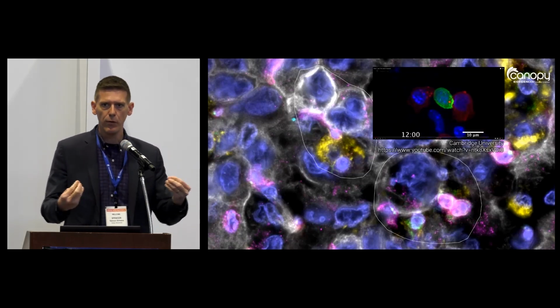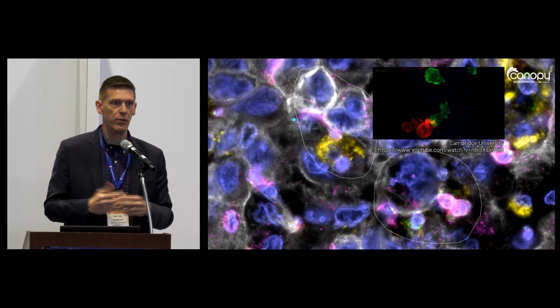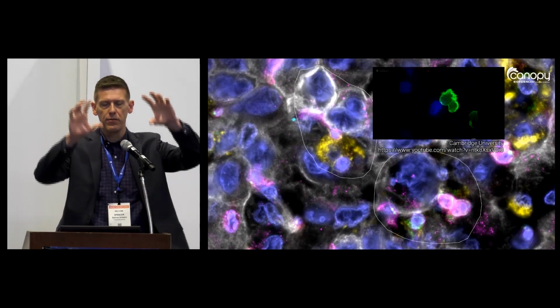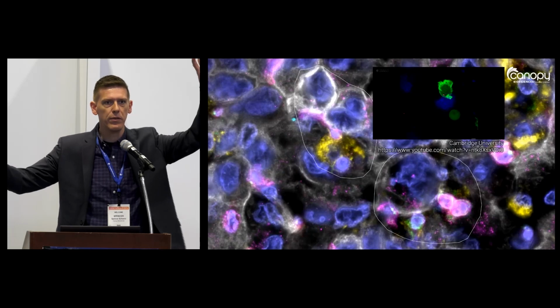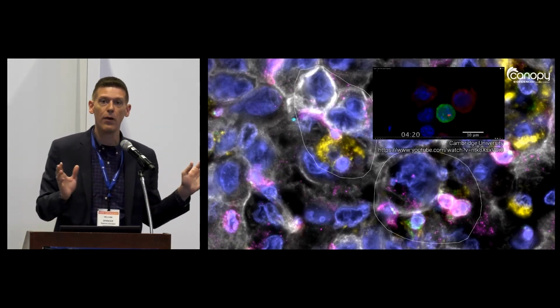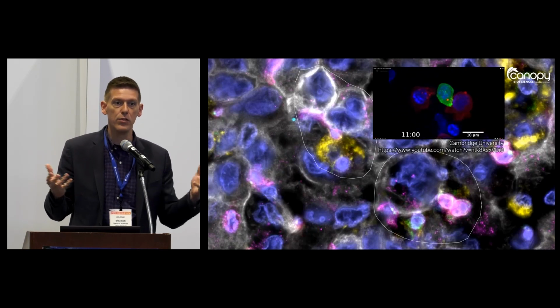So if we encode that through our histology sample as morphology, we can see in the upper left here, I have a T cell in pink that's very stretched out, is trying to interact with these tumor cells. I would suspect that even without other markers, that T cell is active. It's doing its job.